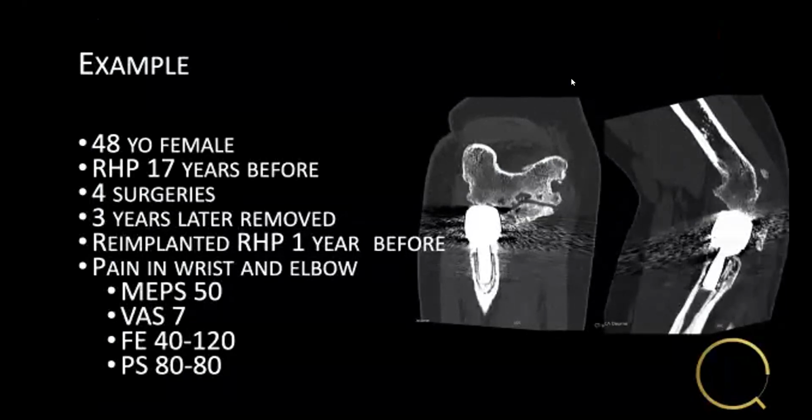And this was her CT scan, and you can see, unfortunately for this lady, that there's severe ulnohumeral degeneration as well, maybe because of the prosthesis being over-lengthened a little bit, and this was supposed to be an intentionally loose fit, which obviously is not the case.